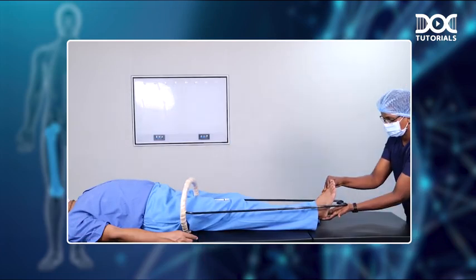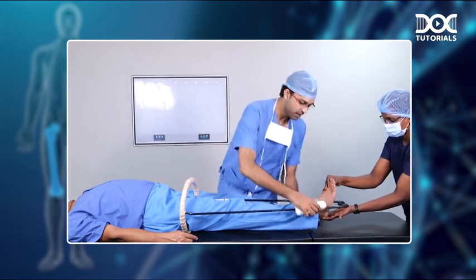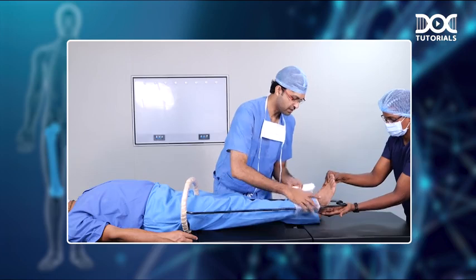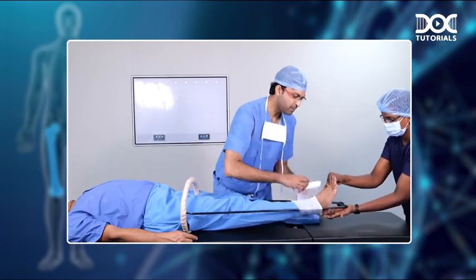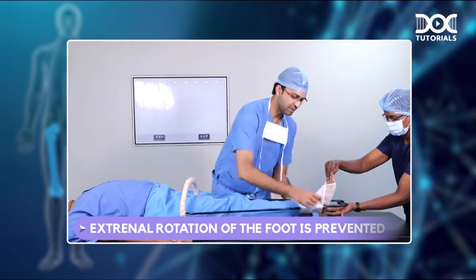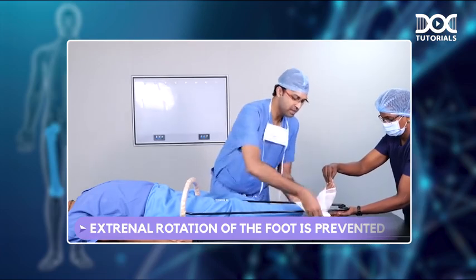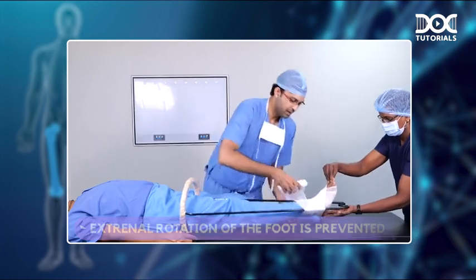And once that is done, you can apply bandages to secure the limb. Make sure that the limb is in traction, and apply the bandage in such a way that external rotation of the foot is prevented like this. If you wind it around the foot like this, then it will prevent the external rotation of the foot.